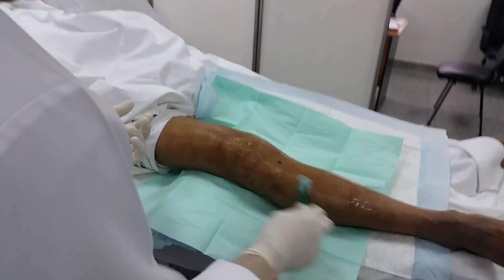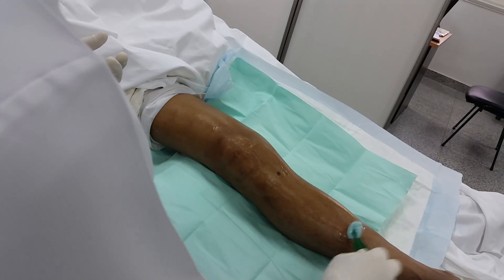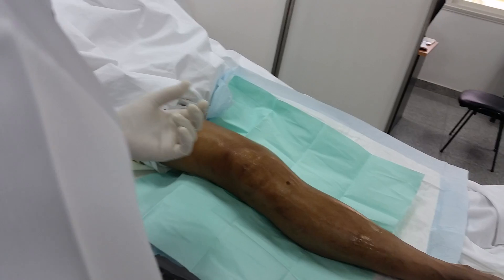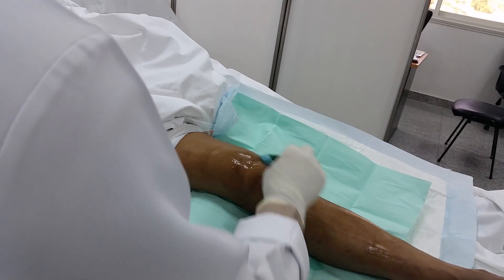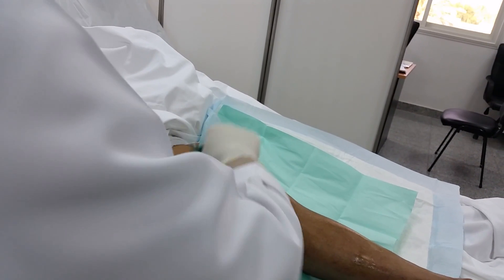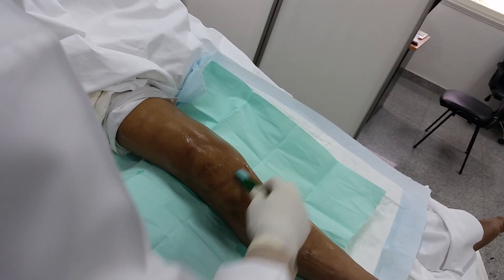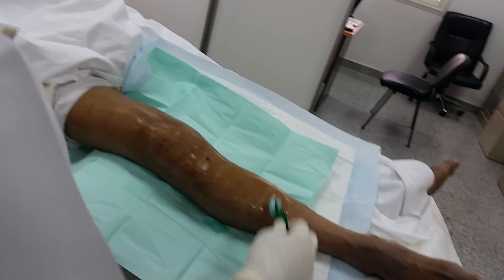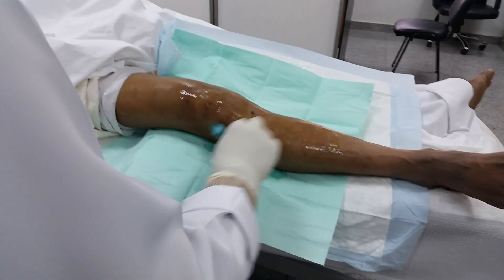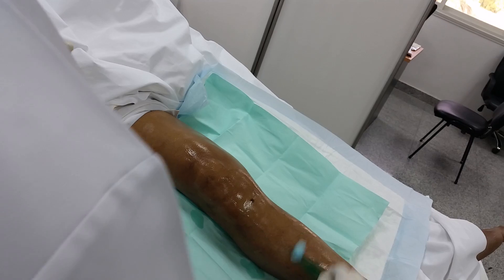This area may be touched during milking and aspiration of the knee, so this area should also be covered sterile — this is the first trick. So the whole field should be sterile. Then for the third step, sterilization — give me one needle to make a mark.